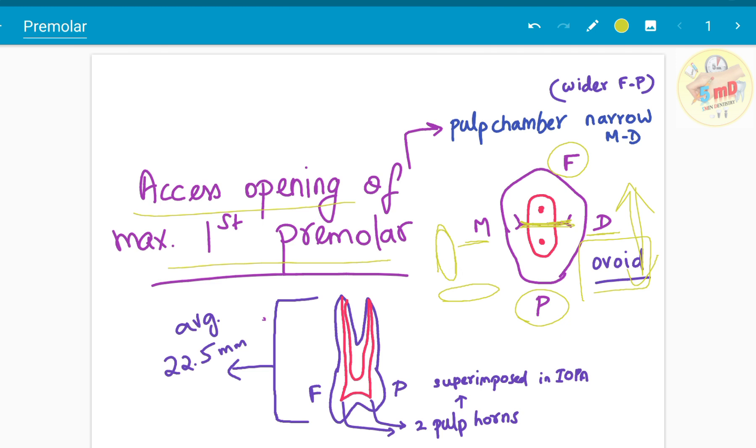The average length of the premolar is 22.5 mm and when you locate the canals in the IOPA, the canals are usually superimposed in IOPA. But two pulp horns are present, which you have to keep in mind.